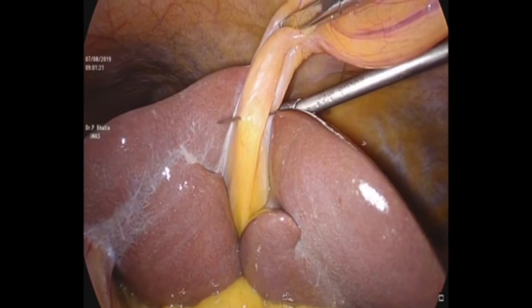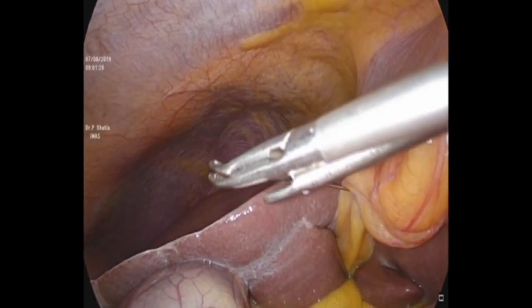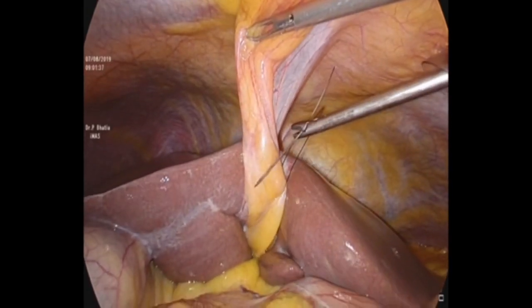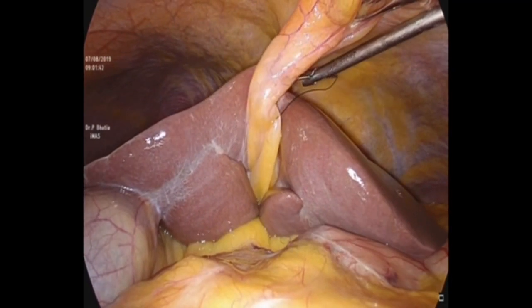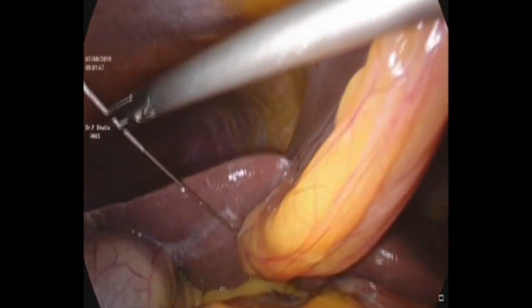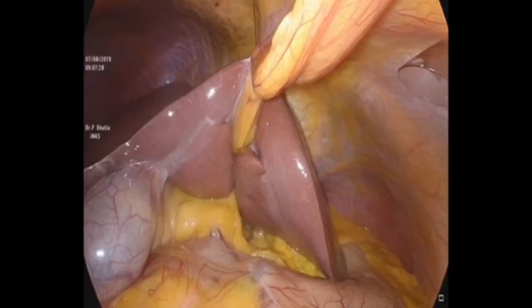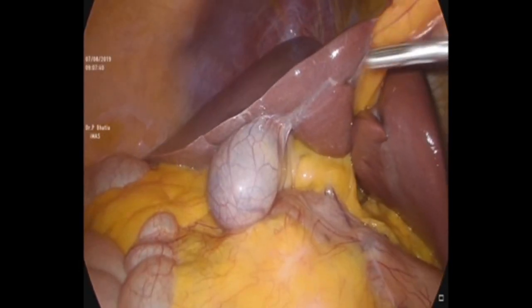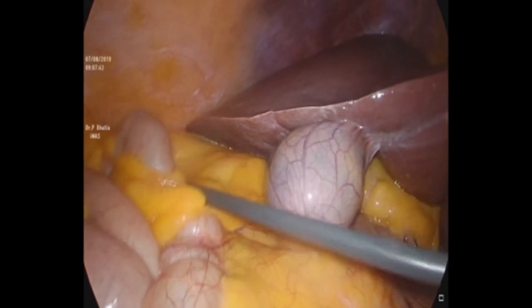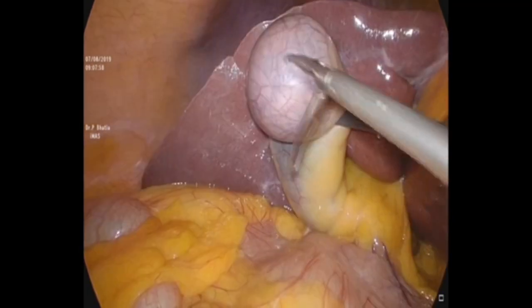Step 1 is to fix the falciform ligament to the anterior abdominal wall with the help of monofilament nylon on a straight needle. It is hitched to the anterior abdominal wall for better visualization of the porta hepatis.